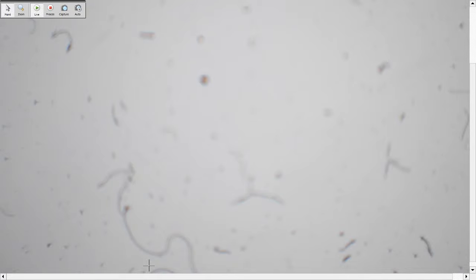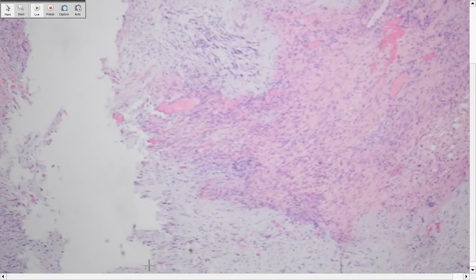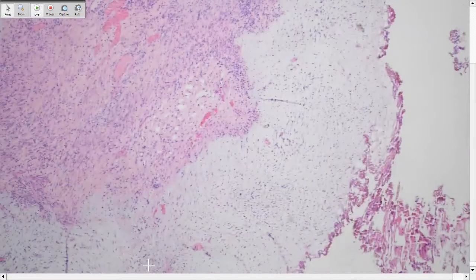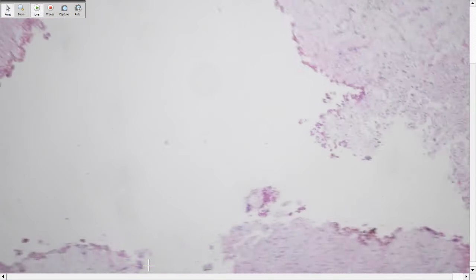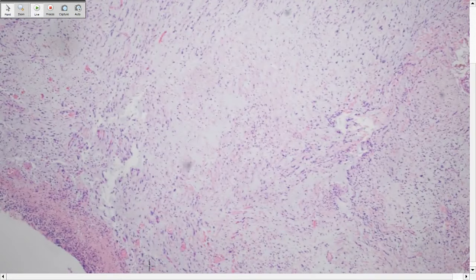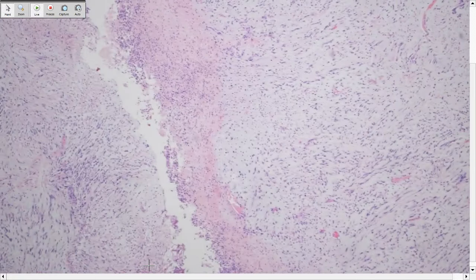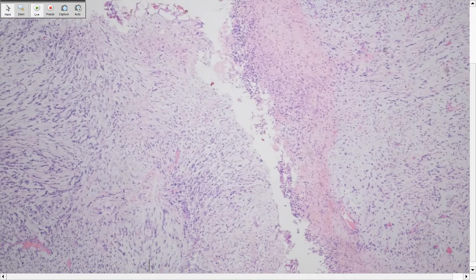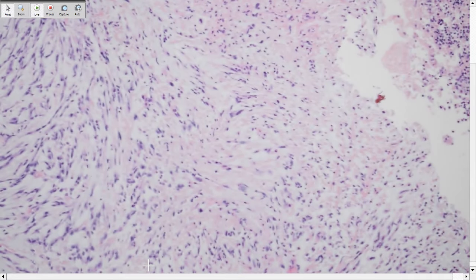No? Okay. So this one is a 79-year-old female with a bladder lesion, hemorrhagic, and it's a big lesion. It has a myxoid background. This is a resection, right? Yes, it's a resection because it's big, about 5 centimeters. Let's focus on this area.